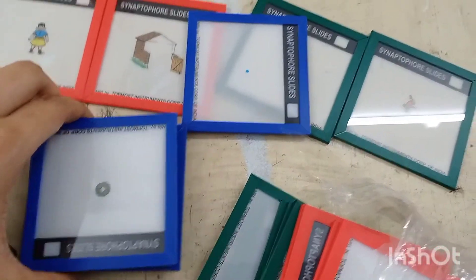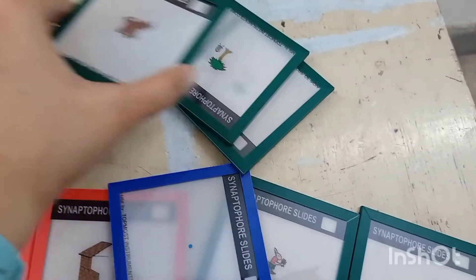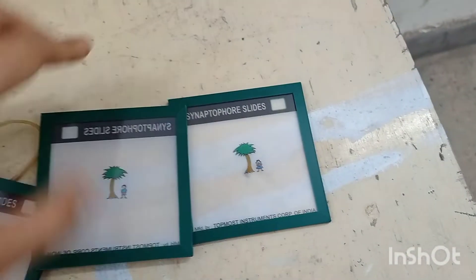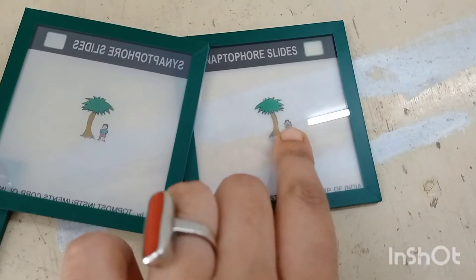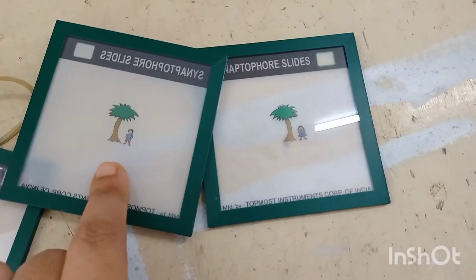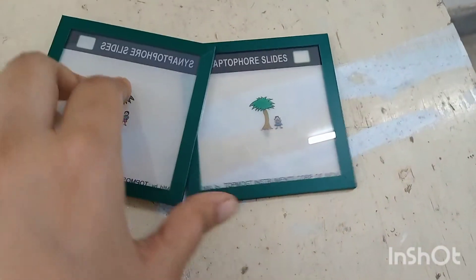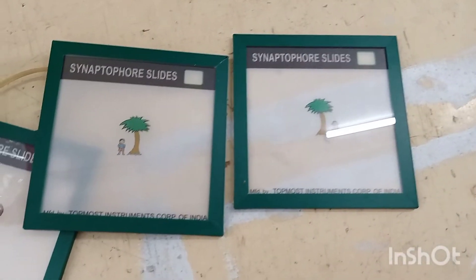Now coming to other slides — we have some stereopsis slides also, though I am not currently having those. Here I am showing the fusion slides. These are used for testing NFV and PFV. Here are two trees; you can see one boy and one girl standing. When you fuse with both eyes you will see one single tree and one boy and one girl.